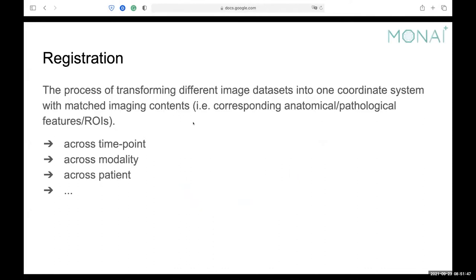Registration is the process of transforming different image datasets into one coordinate system with matched image contents. You can do registration across multiple different scenarios. For example, you can do registration across different time points.